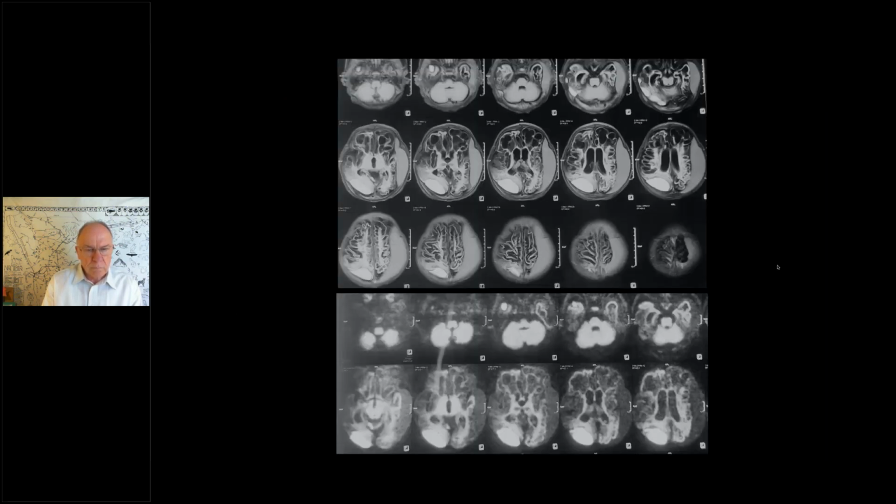So I have only external films. On top is the FLAIR axial sequences. And here you can appreciate there is extensive multicystic encephalomalacia involving the bilateral cerebral hemispheres, also in the subinsular regions. What you can appreciate is that the deep gray nuclei are relatively spared, that is the basal ganglia is spared, whereas the thalamus demonstrates some areas of signal changes. There are also bilateral asymmetrical subdural extra-axial collections on both sides.